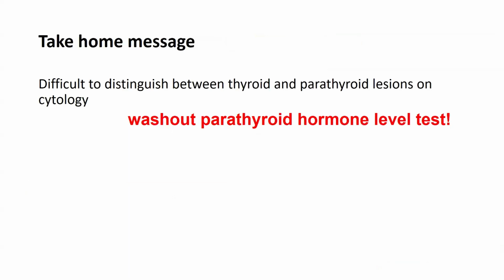In summary, the parathyroid hormone level test is recommended at FNA washouts because it is difficult to distinguish between thyroid and parathyroid lesions by cytology, if you can consider the lesion to be a parathyroid lesion.